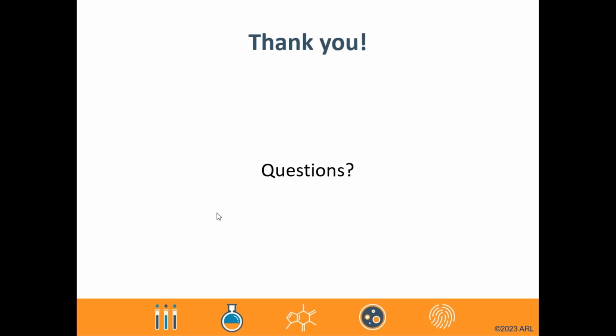How do you handle ATP positive cultures that do not grow when subcultured? So I'm going to answer this assuming that means for the Celsis platform and assuming that means for ARL. So if we get an ATP positive culture that comes in during method suitability testing and it shows ATP presence, that's basically why you're doing method suitability testing, right? You want to determine if there's a method that you're able to overcome the inherent ATP present so that the subsequent test can measure ATP present from microbial contamination, not the sample itself.